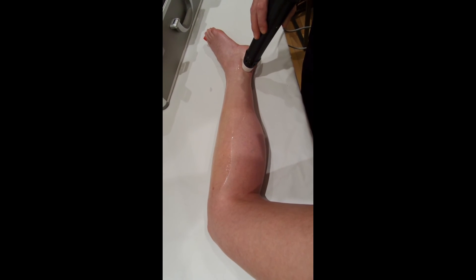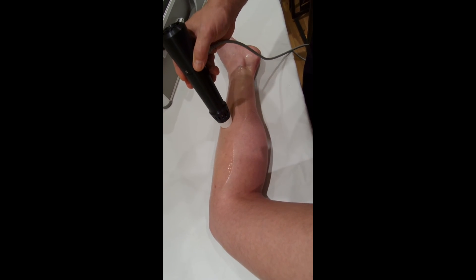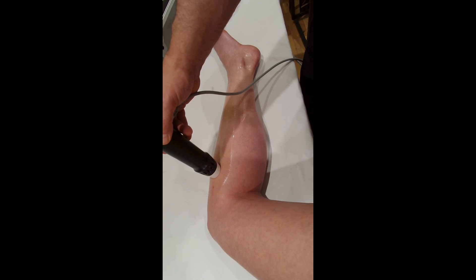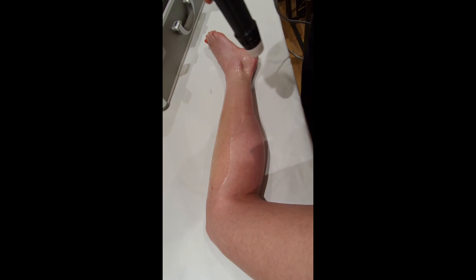Obviously the most common way of working out if you're on the right area is just to see if the patient's in pain. Generally, if they're in pain, you're on the right spot. I've just run out the 2000 shocks here, and that's the end of the treatment.